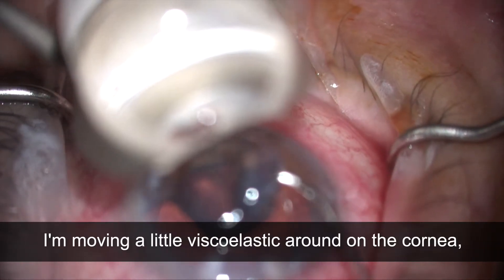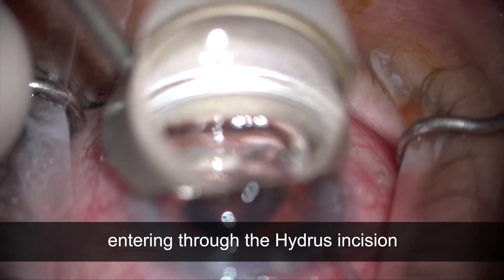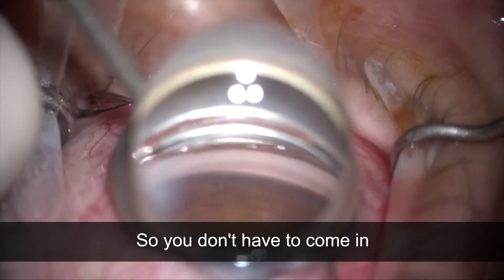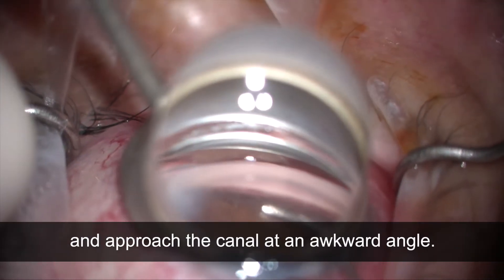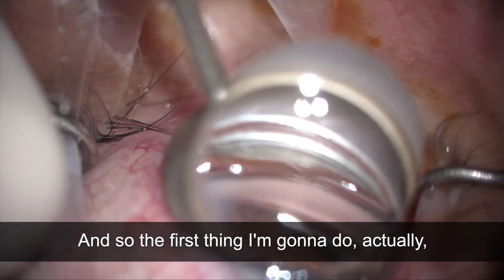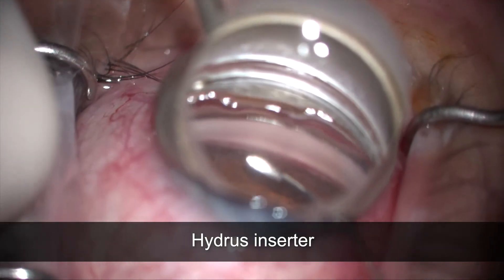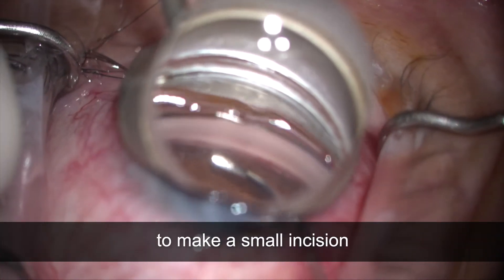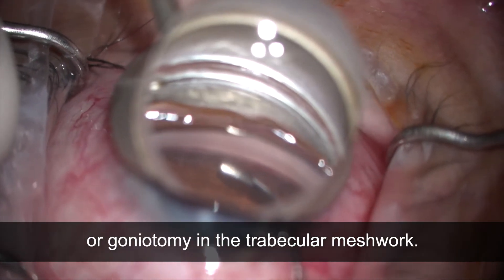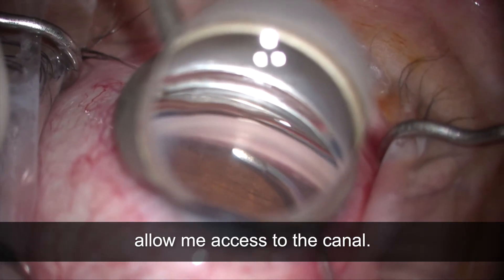I'm moving a little viscoelastic around on the cornea, entering through the Hydrus incision. The Hydrus incision really gives you access so you don't have to approach the canal at an awkward angle. The first thing I'm going to do is use my Hydrus inserter to make a small incision — a goniotomy — in the trabecular meshwork, just to allow access to the canal.